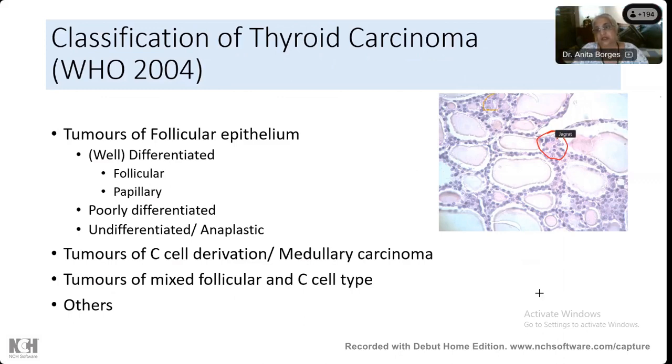Those are C cells. Why do you think they're C cells, Jagrat? They look like thyroid follicular cells, and they've actually got a little bit of vesicular change. Whose orange thing is that? Me, ma'am, Vrushali. So Vrushali has marked something that are very likely to be C cells. You see them? They have little larger nuclei. They may even have a nucleolus. So that is what is a parafollicular C cell.